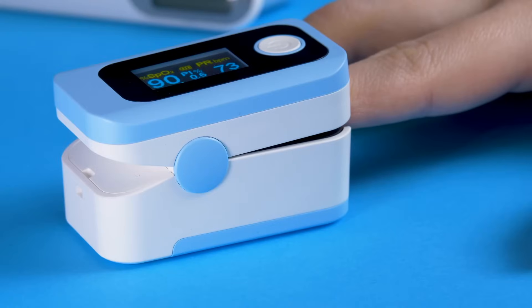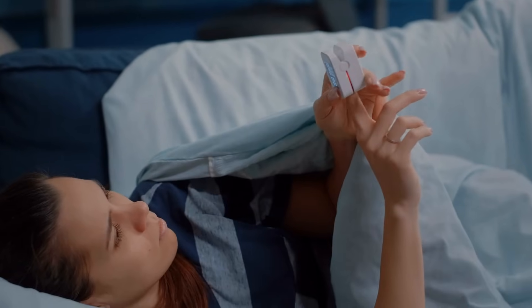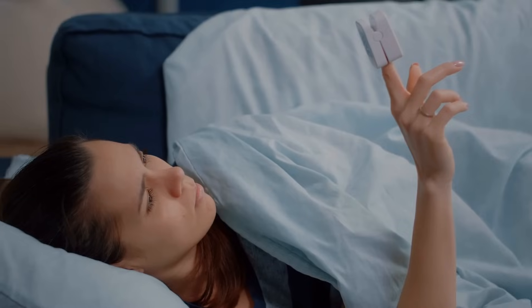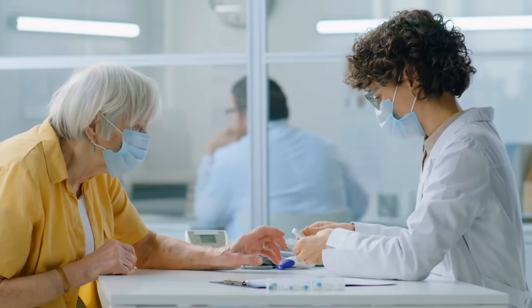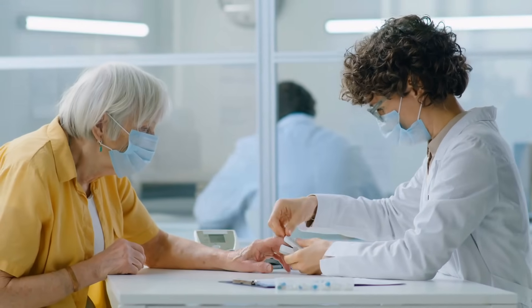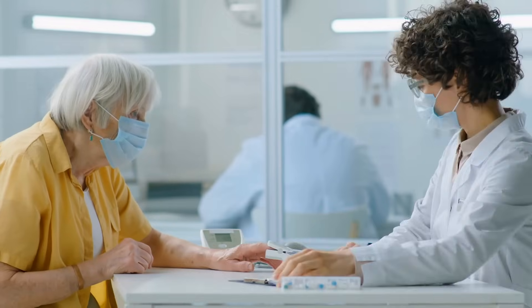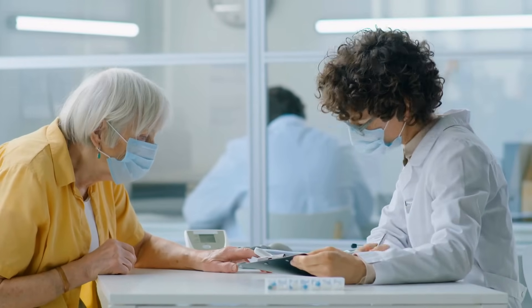The finger isn't the only spot where a pulse oximeter can work, but it's the most convenient. Fingers are packed with capillaries close to the surface, making them ideal for accurate readings. Plus, they're easy to access, unlike your toes or earlobes, especially in a medical emergency. When you clip the device onto your finger, it ensures steady contact between the light sources, your tissues, and the photodetector. This setup minimizes external light interference, providing precise measurements.